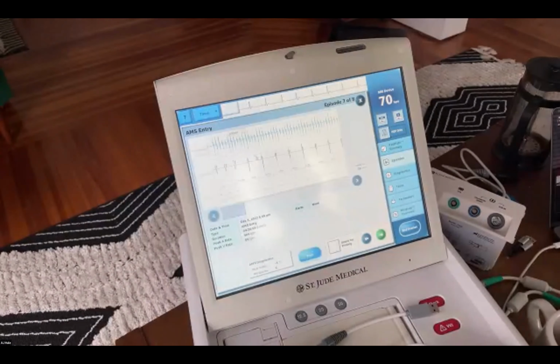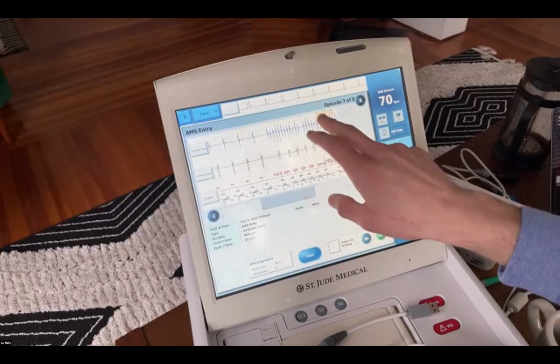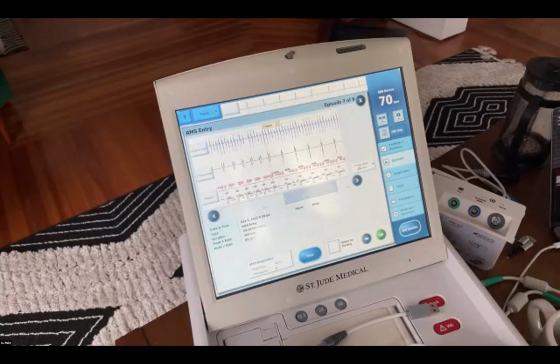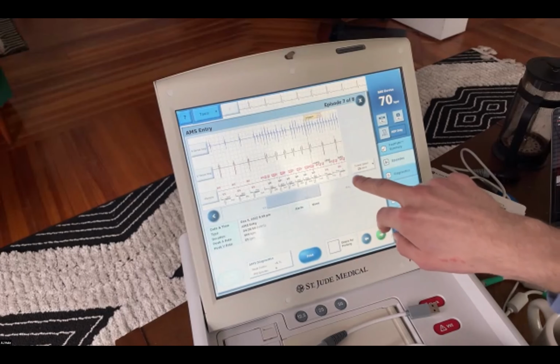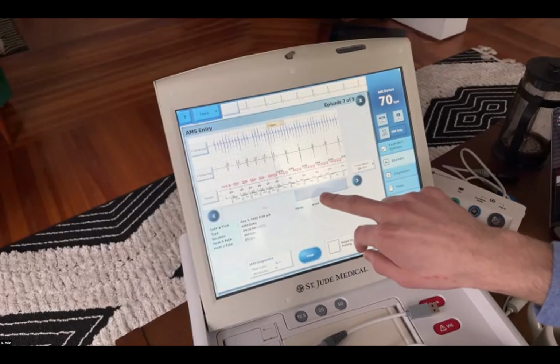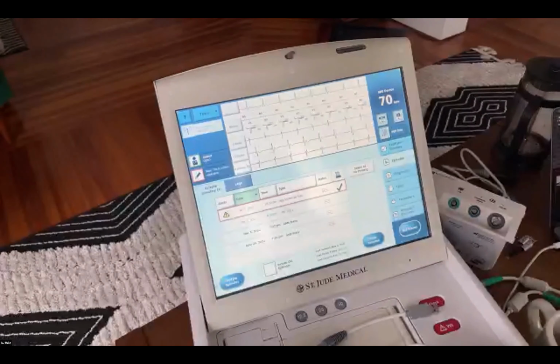Let's go to the next episode here. Here you can see they've had some sort of AFib going on. It looks like AFib, not noise, but you never know. You might want to look more closely. You can see here in this case, the device starts to track the high atrial rate. When it reaches enough to mode switch, it then goes to a ventricular based timing and allows a patient to conduct intrinsically.